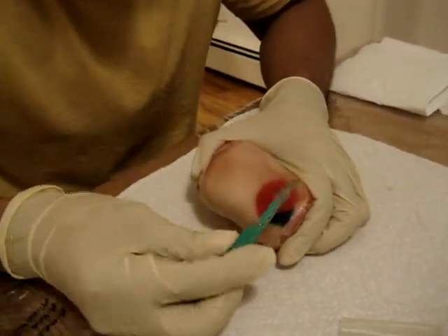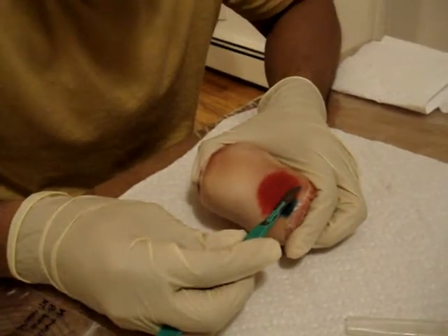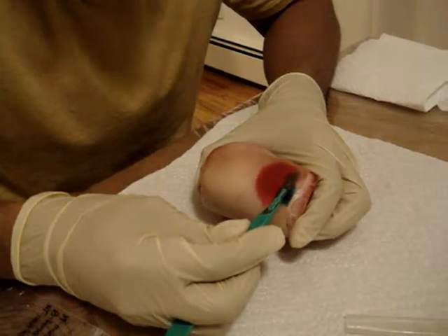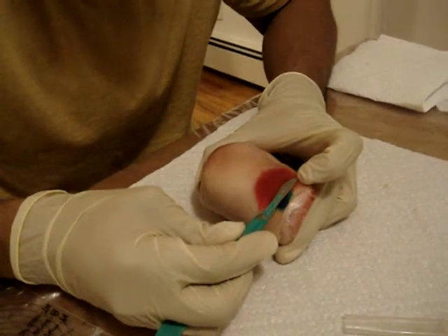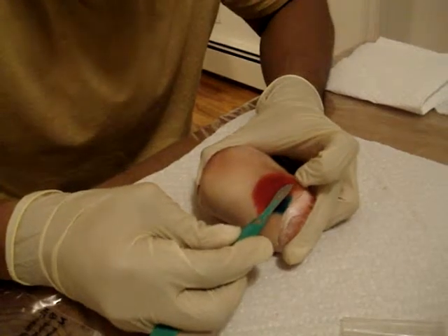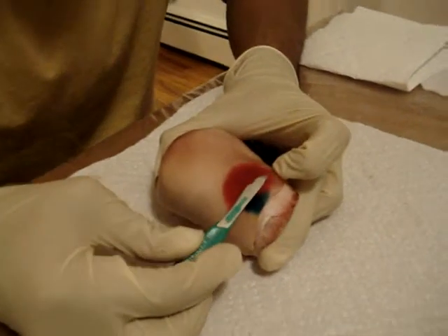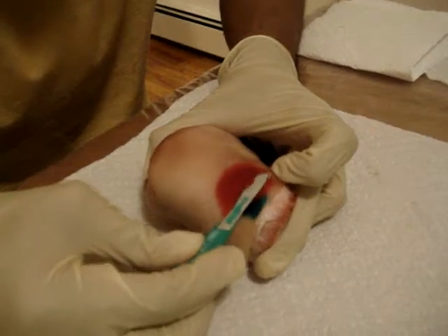We are going to angle the scalpel a little like this, so that we are sure that we can carve something out of the skin. And then if we have already carved a little something, it is time to flatten our blade and start little sawing movements using our fingers and wrist.